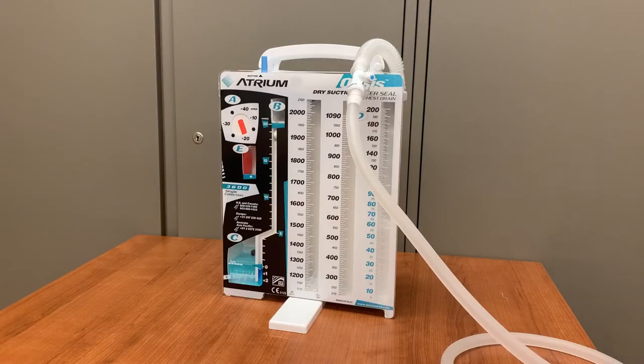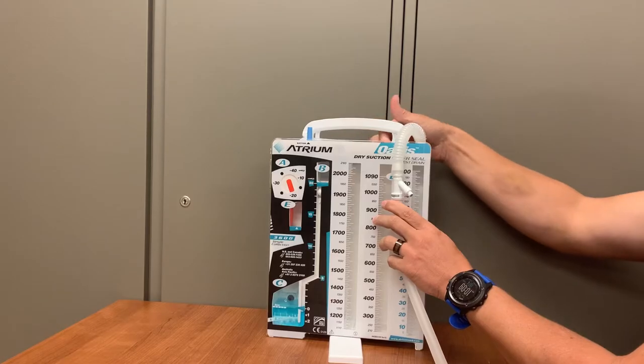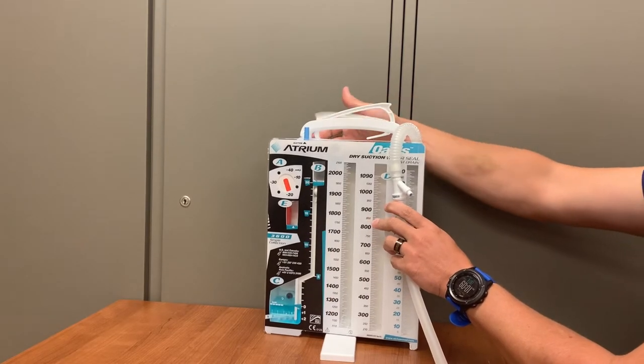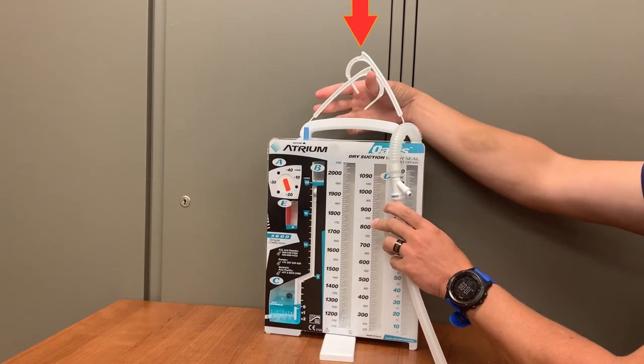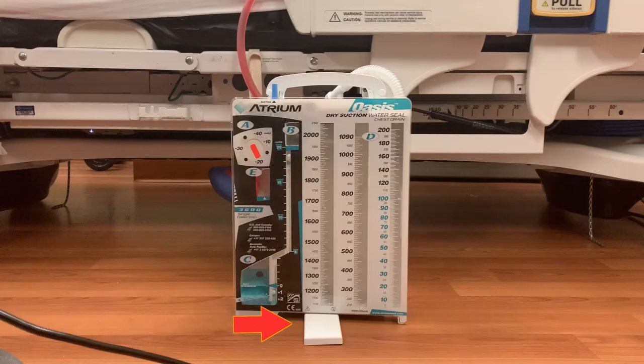A small needle-less port can be found proximal to the inline connector; this is used to remove fluid samples. Contained in the handle of the Oasis are two hooks used to secure the unit to the bed. This device can be either hung from a bed or placed on the ground when the attached stand is used.